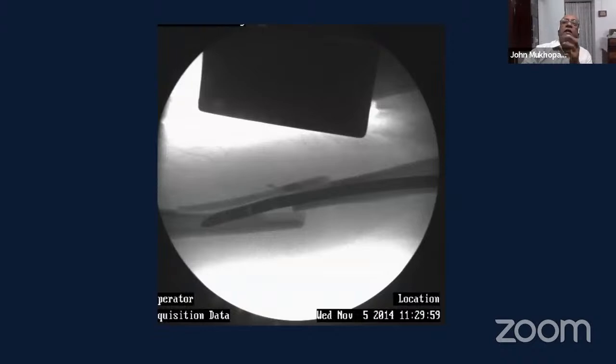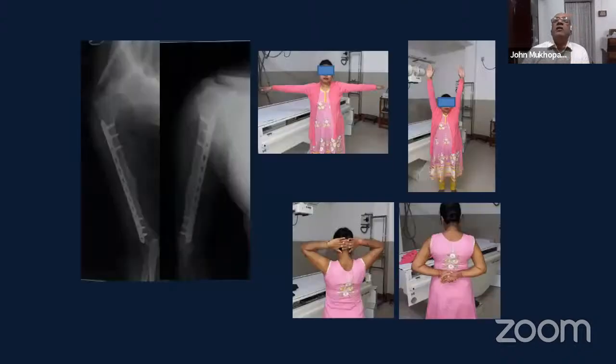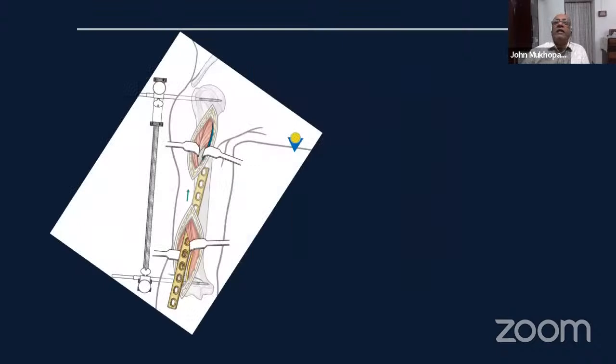So what we did was, again, we used these two pins proximally and distally, and then passed a plate and fixed it minimally invasively, with three screws proximally and three screws distally. And this is her follow-up. You can see how nicely this has gone on to heal with a good function. So MIPPO can get you out of difficult situations where you're trying to do a nailing, etc.